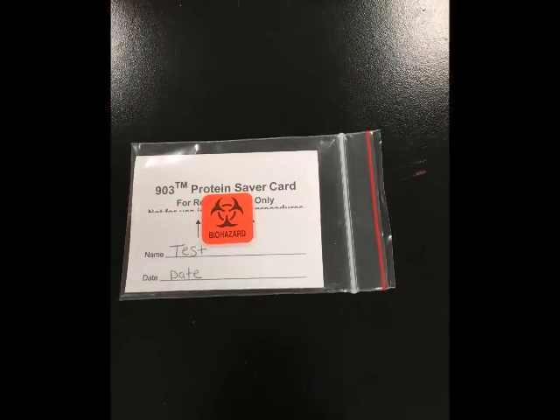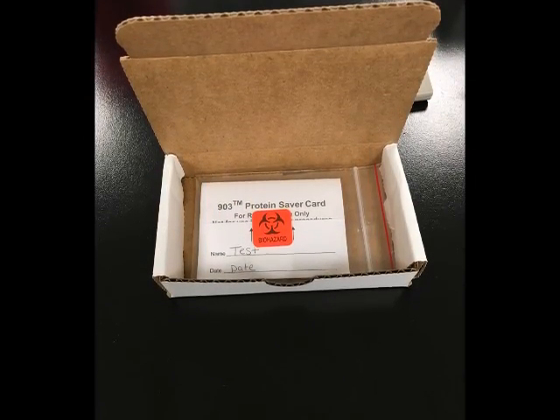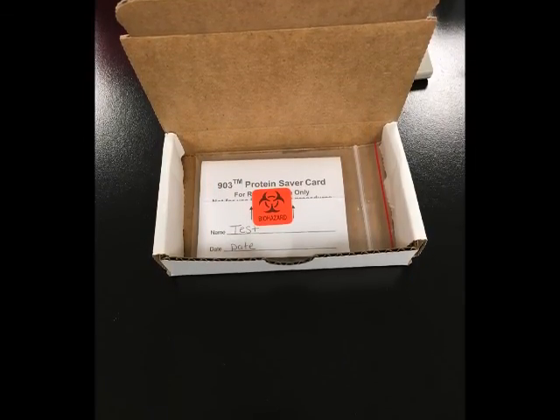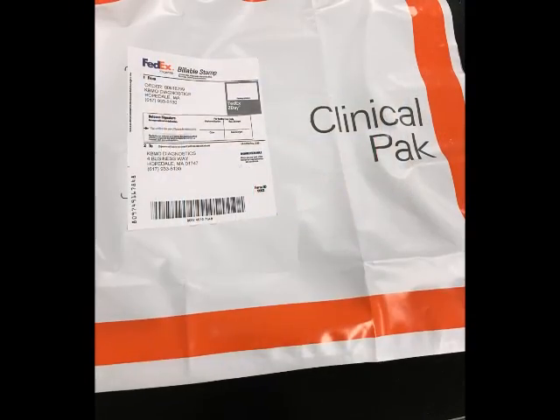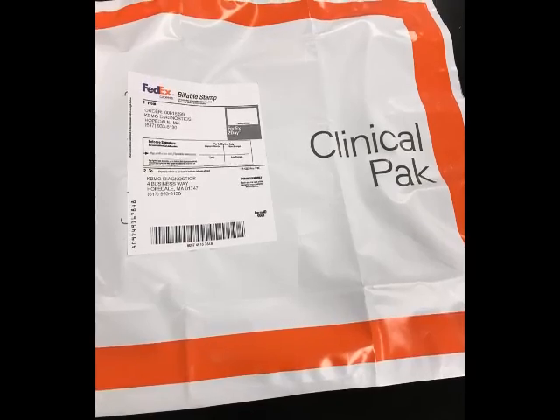Place the card and completed requisition into the box. Place the box into the FedEx envelope and affix the pre-addressed prepaid billable stamp on the outer envelope. Mail the package as soon as possible.